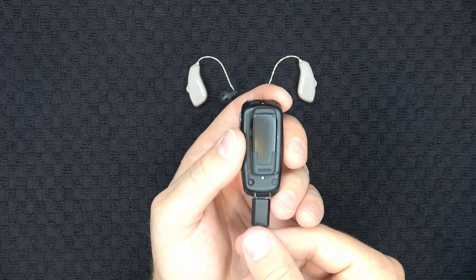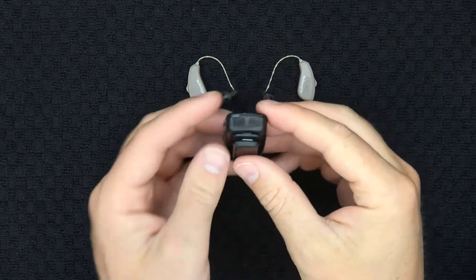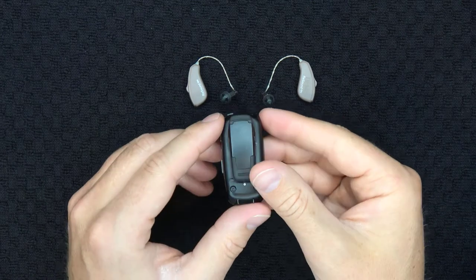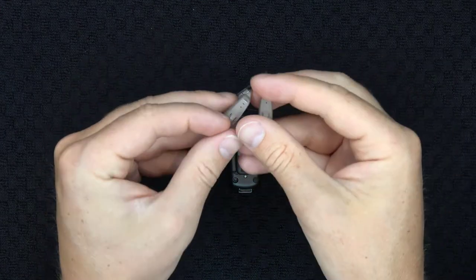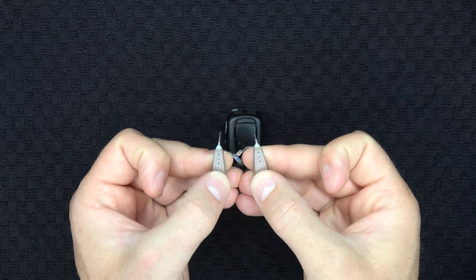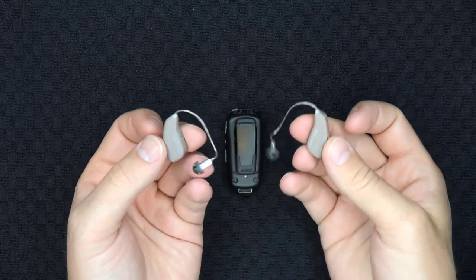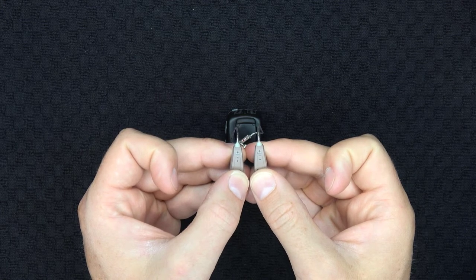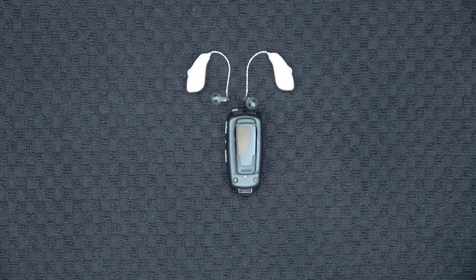Before we can use any of the remote microphone features of the Micromic, we must first wirelessly connect it to your hearing aids. To do this, start by turning the Micromic on by pressing and holding the power button on the top right-hand corner until you see the status light become illuminated. Next, restart your hearing aids. If you use rechargeable devices, either insert then remove your devices from your charger, or press and hold the program and volume control switch on the back of your devices for approximately five seconds until you see three green blinks, then press and hold the same button again to turn them back on. If using disposable batteries, simply open and close your battery doors.